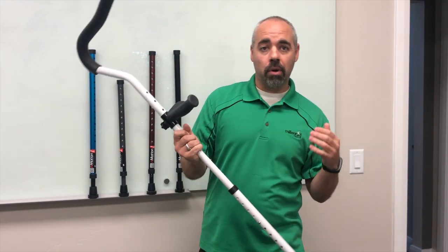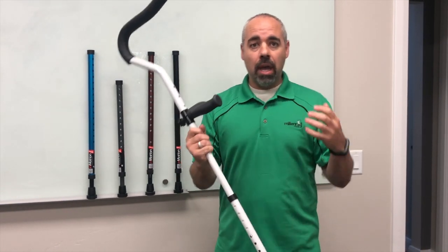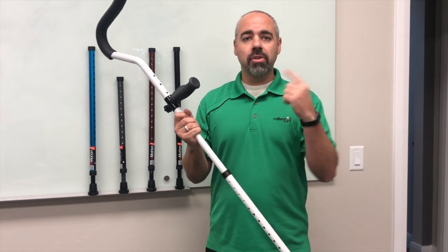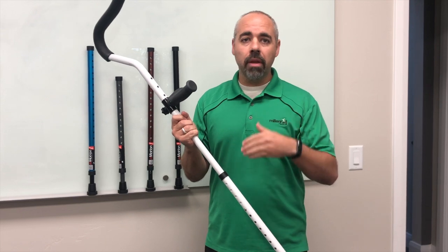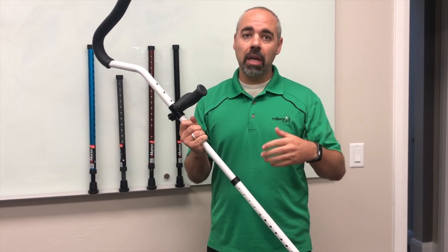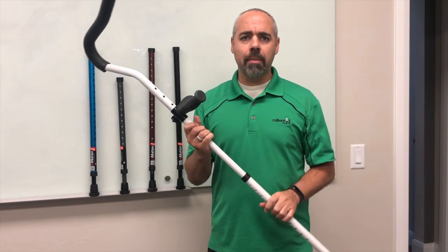We favor one side — we're heavier on one side — and we put more wear and tear on one crutch versus the other. That constant monthly rotation will give you longer life, smoother mobility, and overall you're just going to notice better performance.